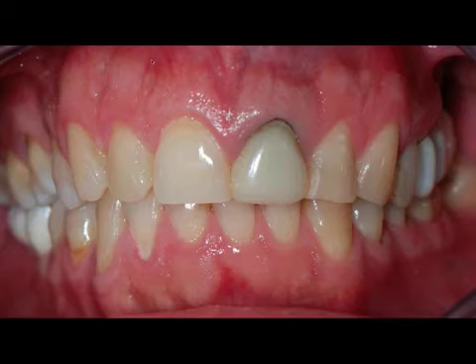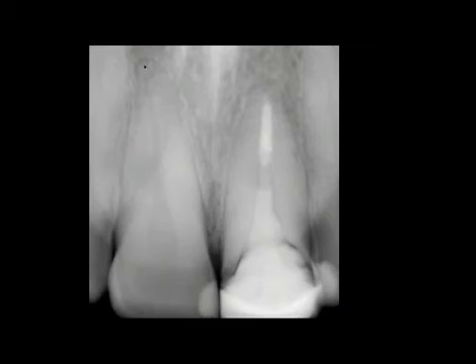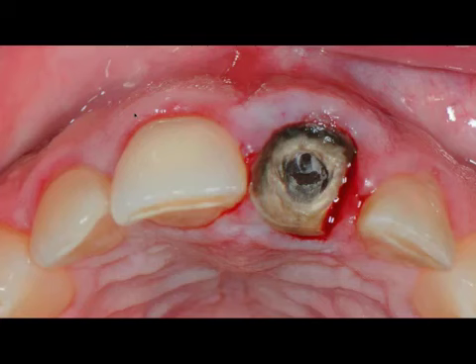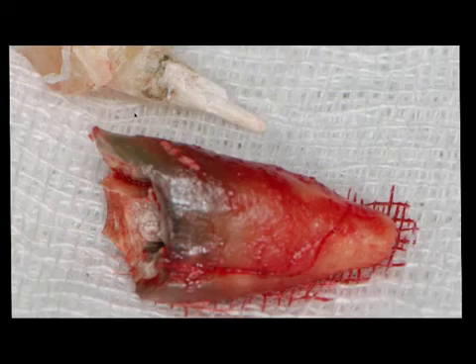So here we have a failed left central incisor. It was a fracture of the tooth, previously endodontically treated. We have a relatively thick biotype. In this case, the atraumatic extraction of the tooth with the vertical fracture evident.